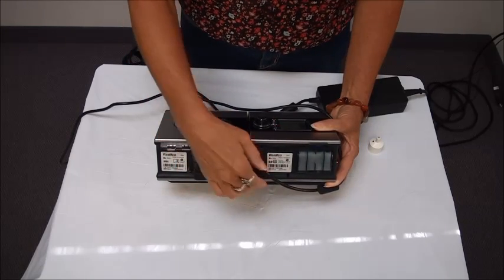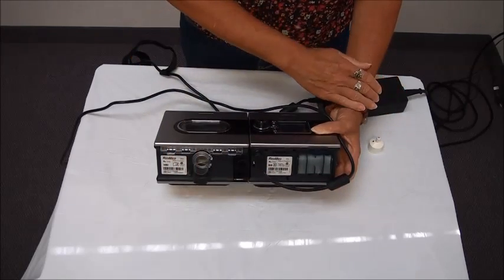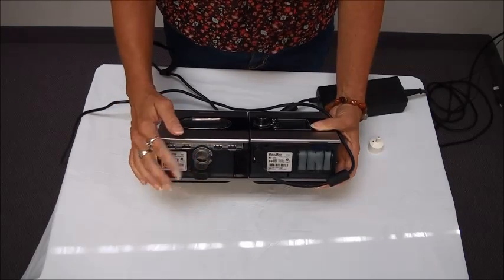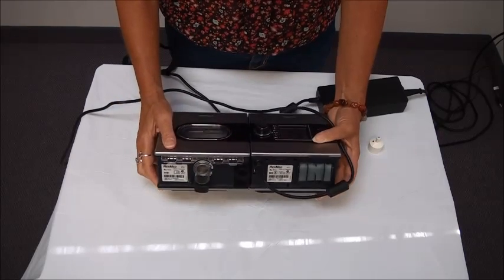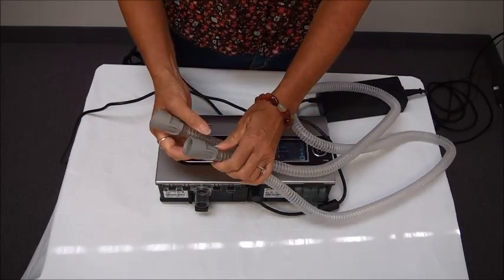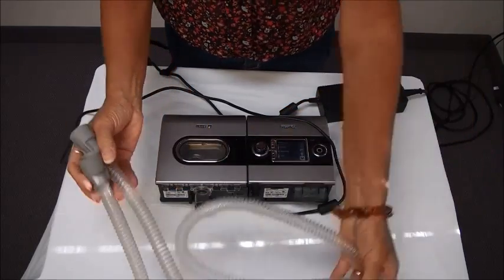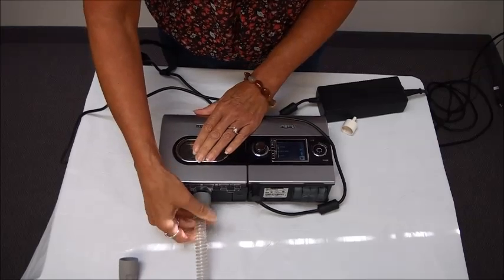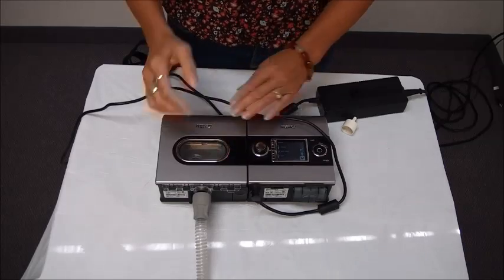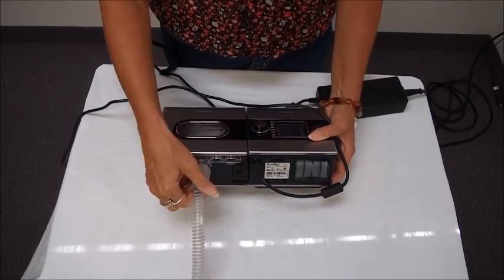Right over here in the middle is where your power cord goes and this just plugs right in and will plug into your wall outlet. Over on this side is where your air outlet is and this is where your tubing will connect to. Your standard tubing looks like this — it's a standard six foot tube, the same on both ends. One end connects to the machine and the other end connects to your mask. This unit also has the capability of using a heated tube which would connect in the same spot.